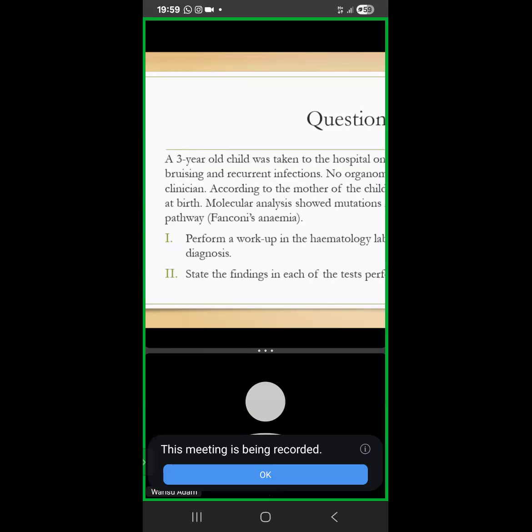I heard the expectation, and I said perfect. I'm asking a follow-up question. What one word would you use to describe the situation? We'll be expecting a pancytopenia in this. Okay, so that will be the guide for you.